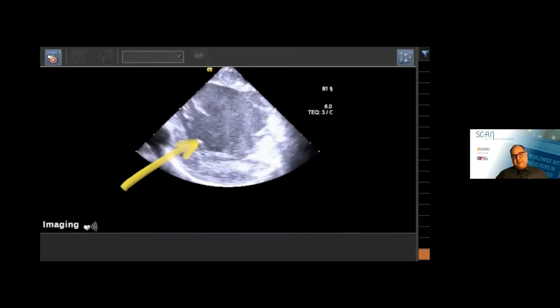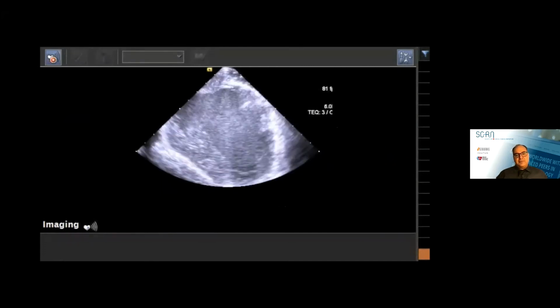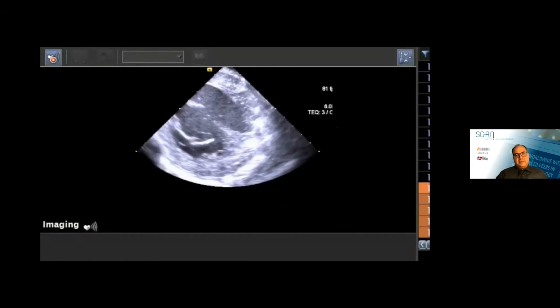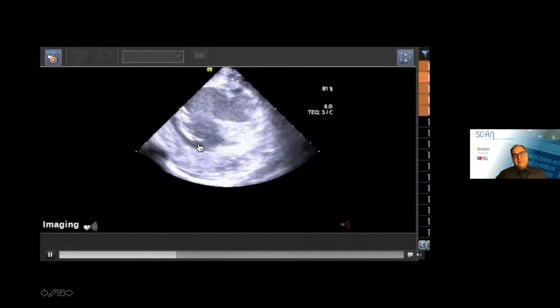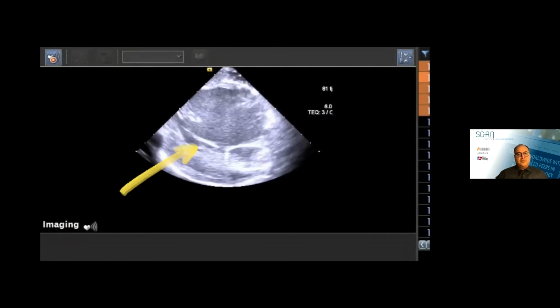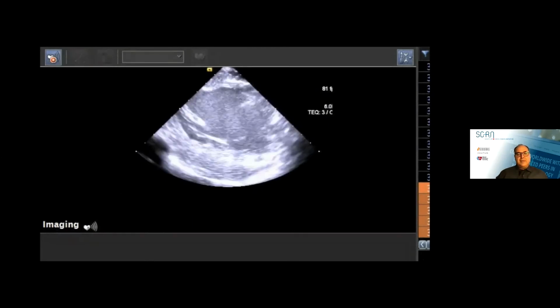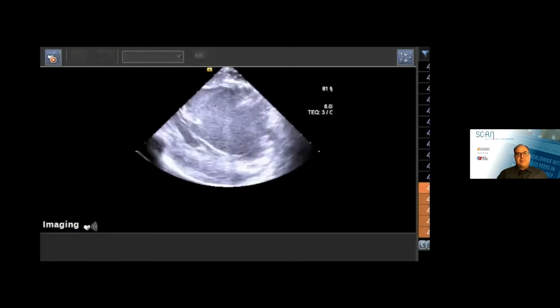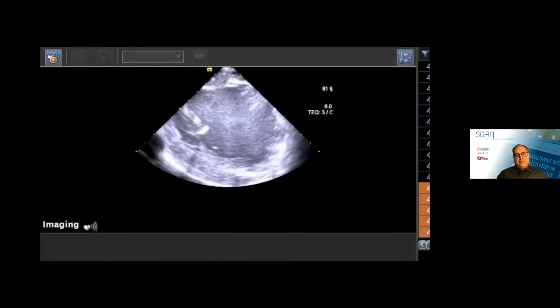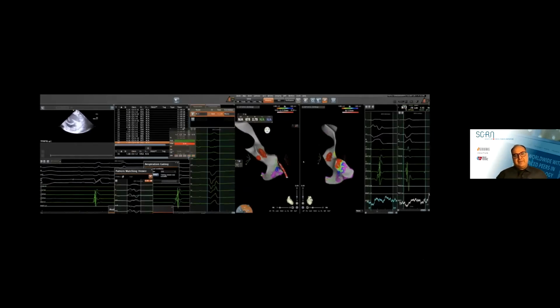Sometimes it gets tangled in the mitral apparatus, so you have to pull it back, bend the catheter, rotate it to release it. In a second, you're going to see that. The catheter is bent in a U shape, so the tip is not traumatic. And once it's released, you can move it around. So we map, we know where the apex is, where the anterior wall is. And we continue monitoring the procedure with the ICE as we're mapping. For the rest of this VT mapping, I'm not going to show the ICE images, or they're very small in the corner, but throughout the case, we'll monitor the location of the catheter and contact with the wall.